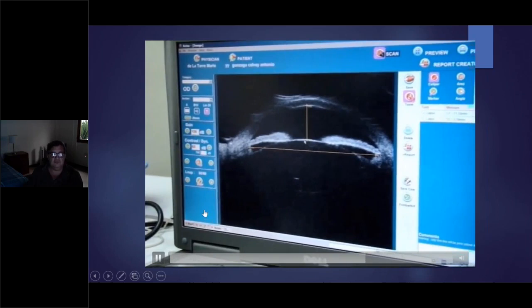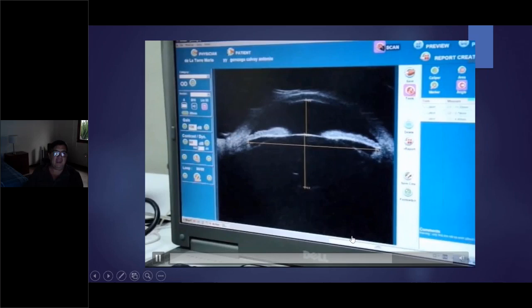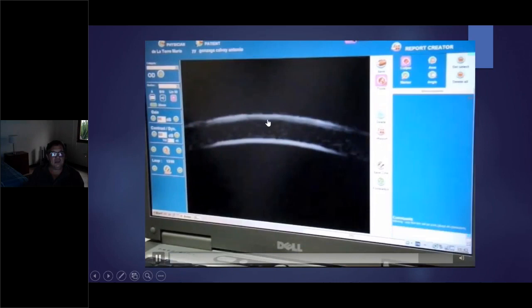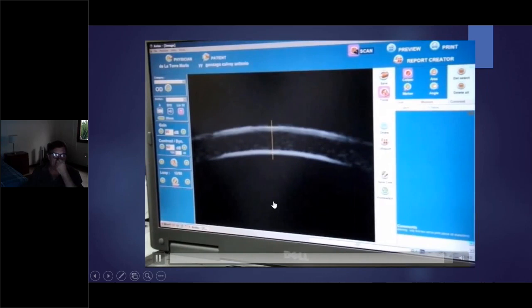Look, very, very easy. You can see the posterior surface of the lens, and you have a complete method to make every measure. Also the angle, you can make the angle this way, all the tools, and you can go through the cornea, decrease the gain, and you can make a pachymetry also in these cases. This is very, very friendly to do with the Aviso. Now with the Absolute it is much better, but the Absolute is a new machine. And look, so easy to make the examination.